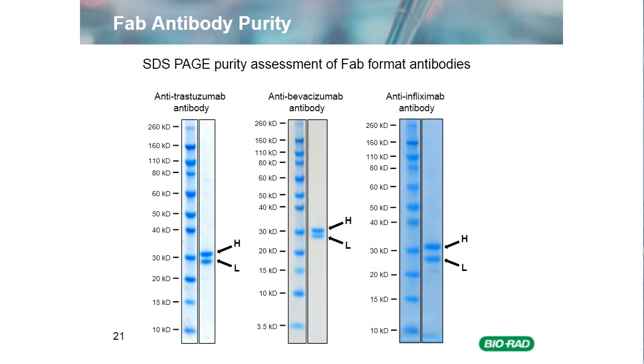So from the reliability of the production method to the purity of the antibody itself, antibody suppliers will, or at least they should, assess the purity of their products, perhaps with the exception of serum-grade polyclonal antibodies. And if you have a requirement for the purity of individual lots to be recorded, this is something that the supplier can often offer as part of a package if you require a more comprehensive set of QC parameters than the standard certificate of analysis or equivalent supporting documentation.